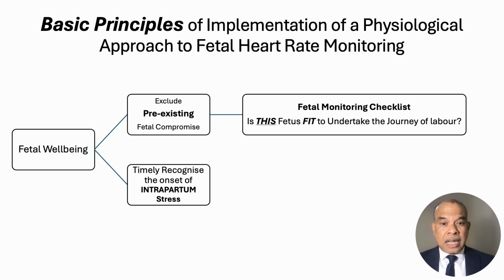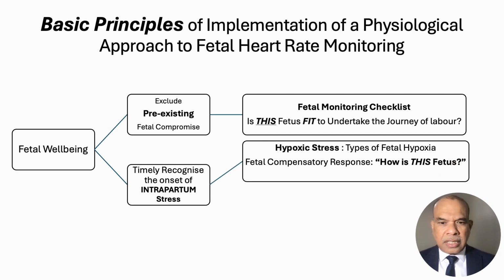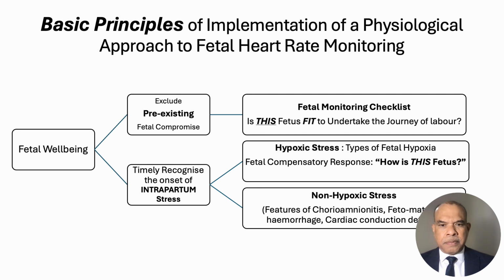Then if there is onset of hypoxic stress, it's important to recognize it in a timely manner, and that's why we have different types of hypoxia and a combination or sequence of features, and to assess the fetal compensatory response to stress by asking the question, how is this fetus?